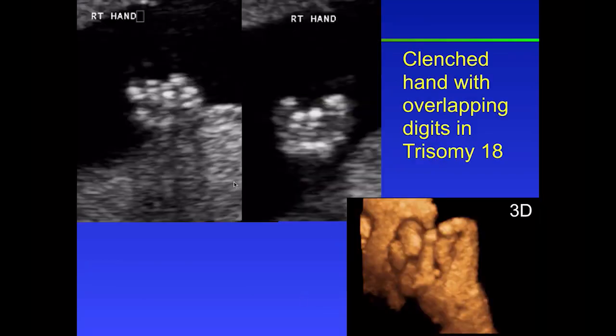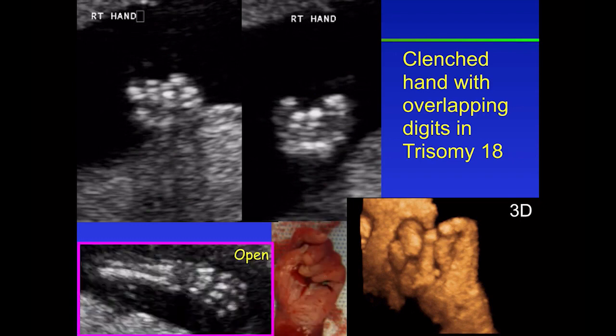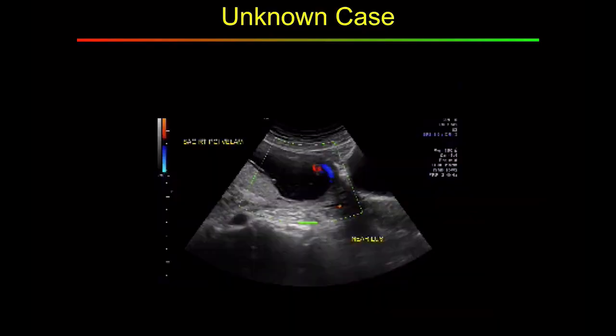These patients get clenched hands with the index finger overriding the other digits. And this is just a 3D picture with that finger overriding. And that's what it looks like on autopsy here with that index finger overriding. Now, in order to call a normal hand, we want to see at least 3 digits with the 3 phalanges on it to prove that that hand is open. We won't accept a sagittal picture of the hand because we've been burned on that.